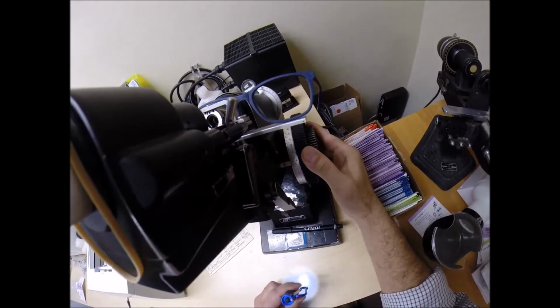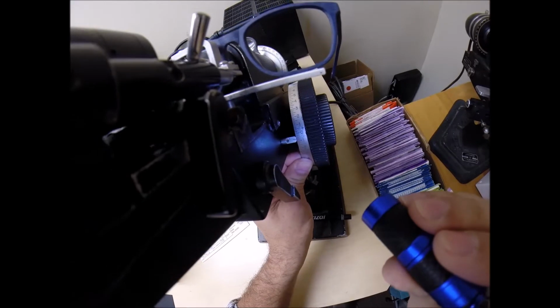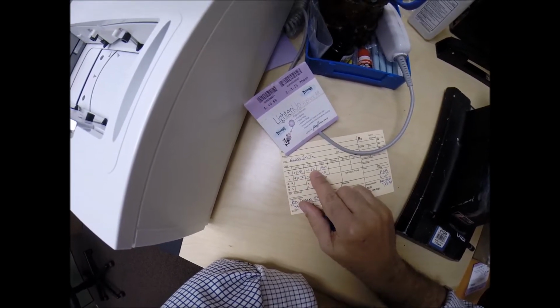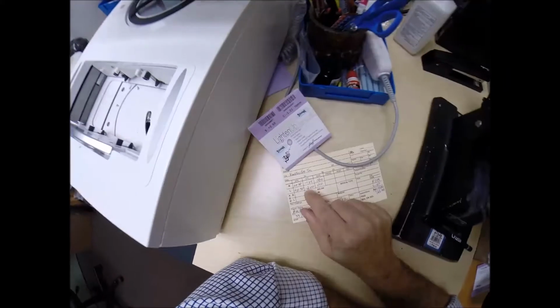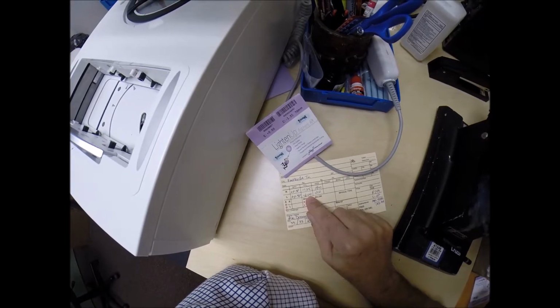We started off at the black .50, plus .50, .50's in the black, and when we turn it 1 1/4 steps, we end up at -.75. That's because if you had 50 cents and you owed someone $1.25, you would be 75 cents in the red. That's where we're at, 0.75 in the red. Now your left eye reads plus .50 minus 2, so we're going to end up at -1.50 for that.